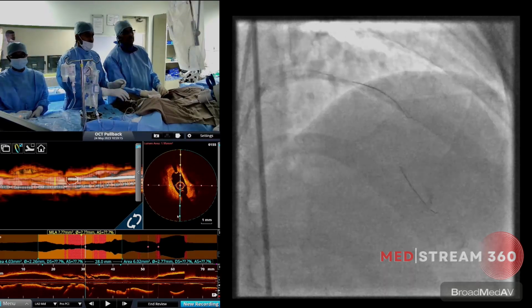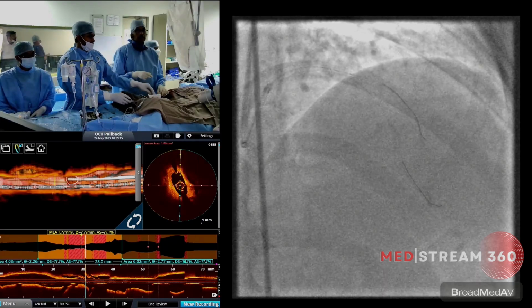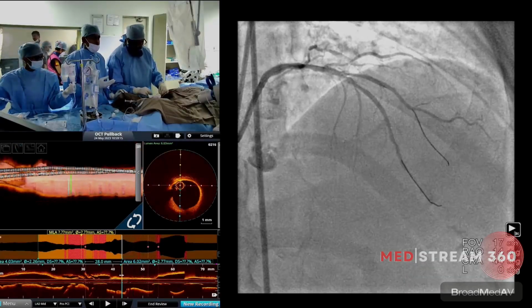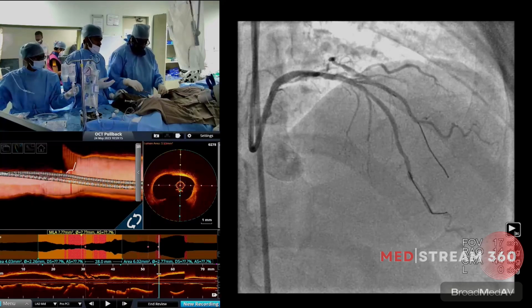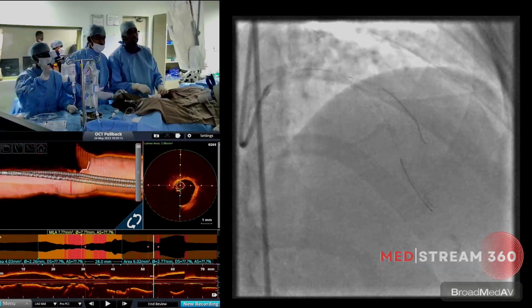Okay. So now I'm going to stent. I'm just asking you, the ostium of the LAD, do you think we need to cover that? No, no, no. So you can see that the diagonal is open, but not good enough, but that's okay. You don't expect more with a ballooning. It was a 2.5 balloon. You went up to nominal. Didn't want any dissection there.